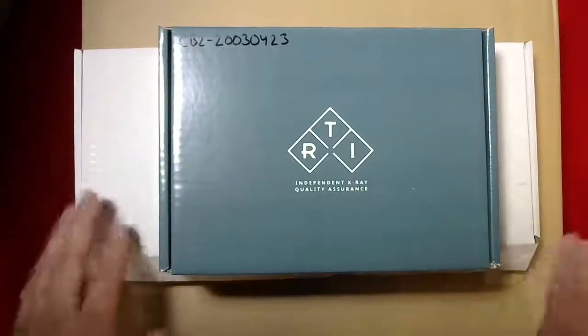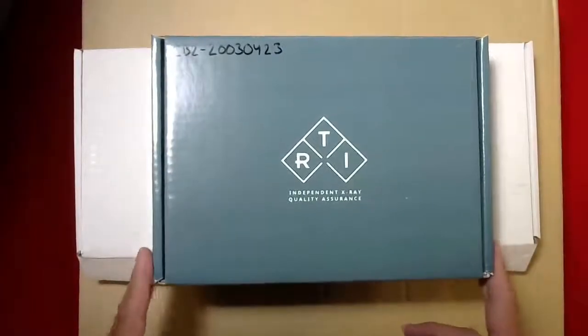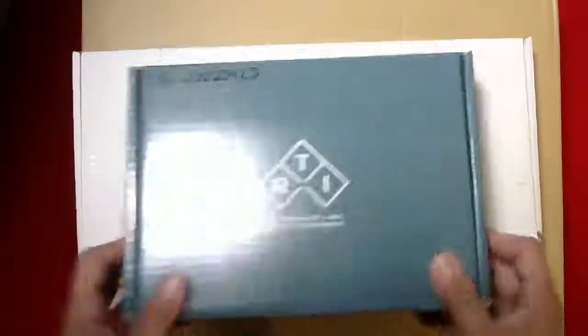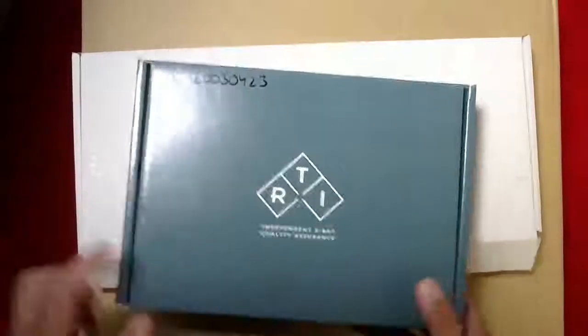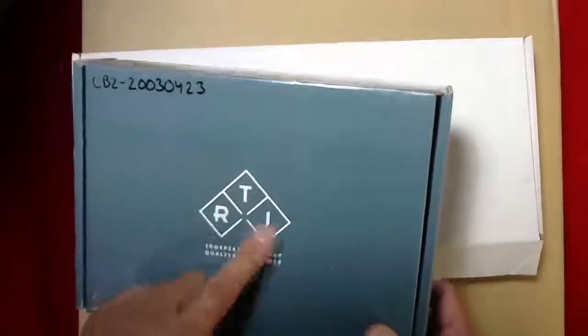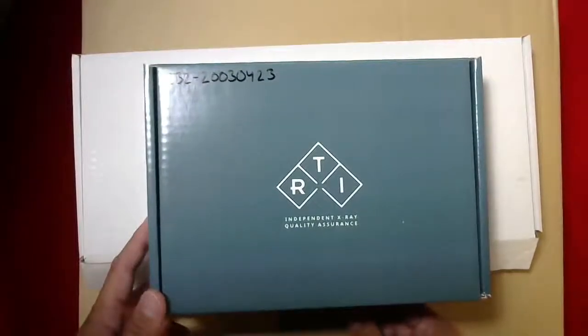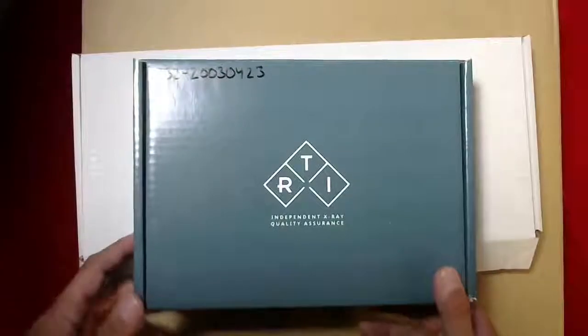Hi, Steve here from CSP Medical. Today another quick unboxing — probably two or three minutes. I'm going to show you the RTI, which is a company in Sweden that manufactures the Piranha X-ray meter. We have been suppliers for RTI for over 35 years, so we've seen a lot of their technology advances, and I'm happy to show you the Piranha today.